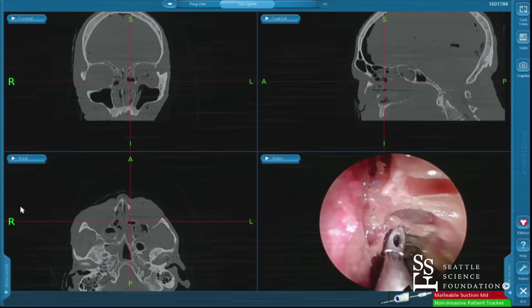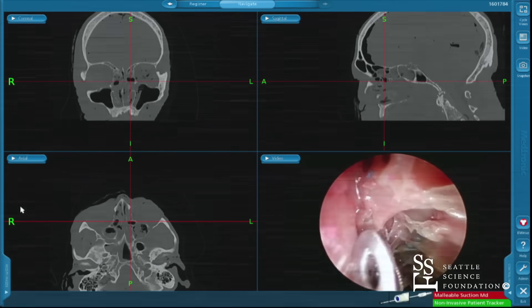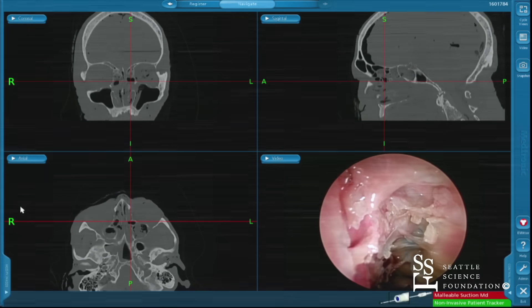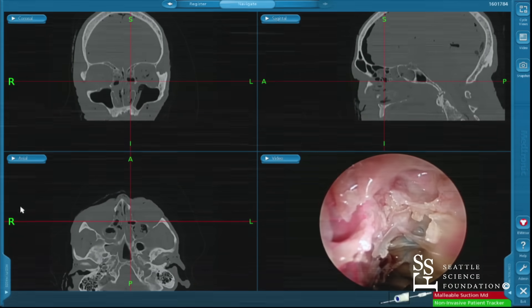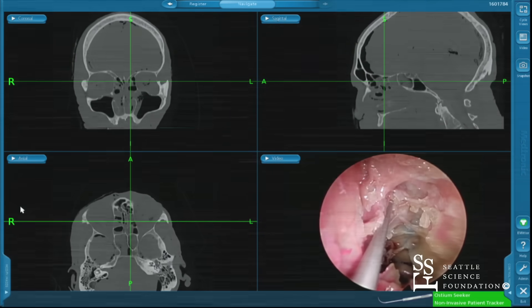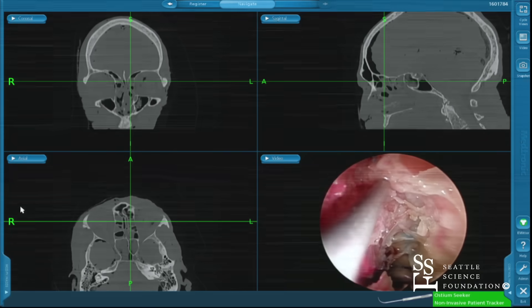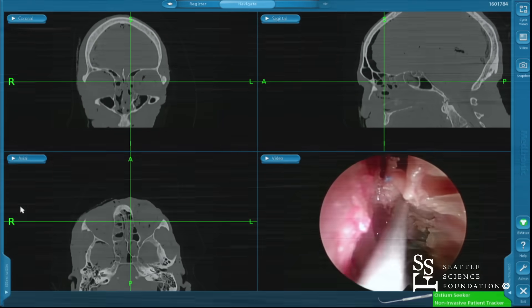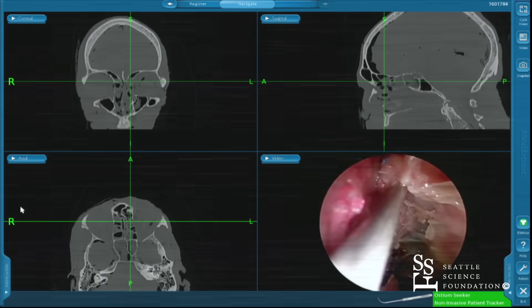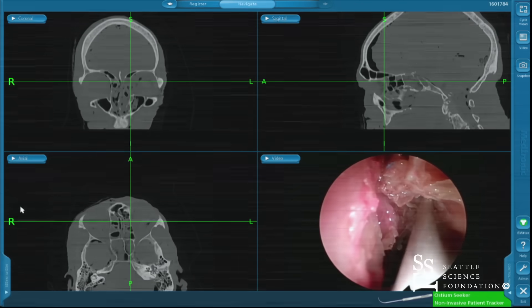The navigator was a little bit low off of the skull base — just slightly low. I'm going deeper than it's actually showing, just by a millimeter or so. This is a good reason why it's good to have a good idea of the anatomy as well as having navigation. It should never be depending on navigation when you can see. I'm using my navigation probe a little bit as a dissecting tool here because it's a very fine and elegant instrument.